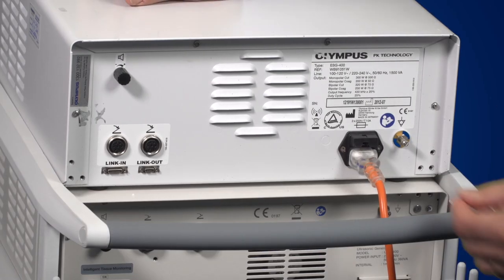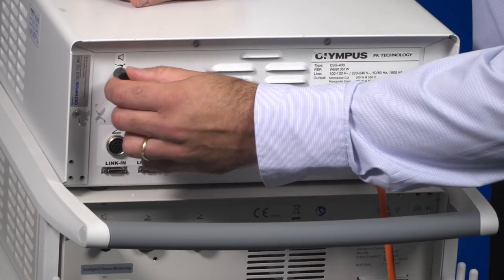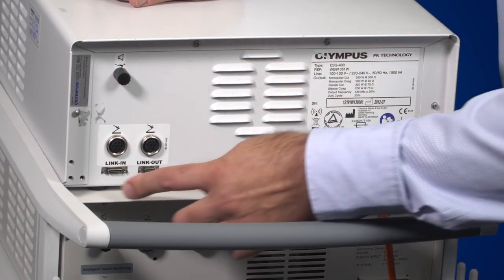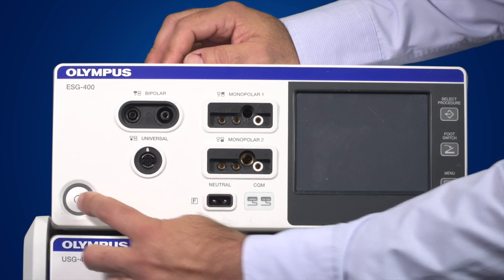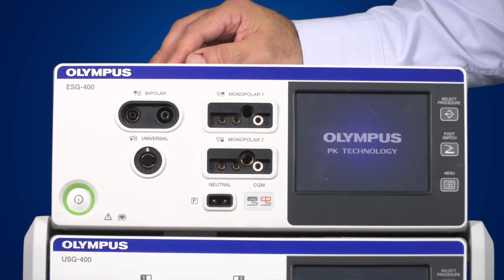On the rear of the generator you have two footswitch sockets, a volume control knob, ventilation holes, and both a link-in and a link-out socket. To activate the generator, simply press the power button. You'll see that it powers up quite quickly and the graphical user interface is activated.